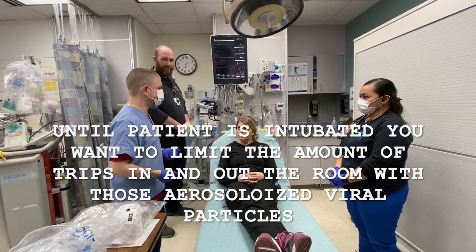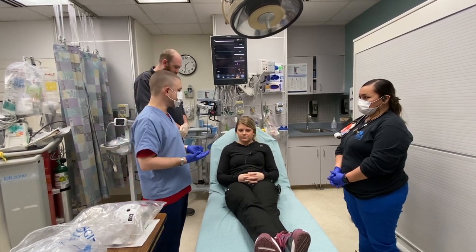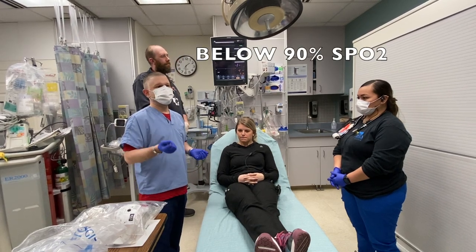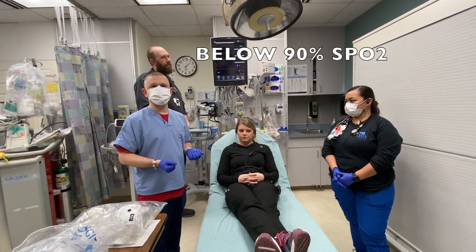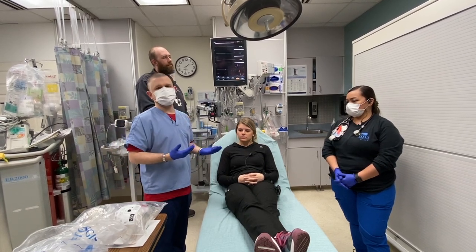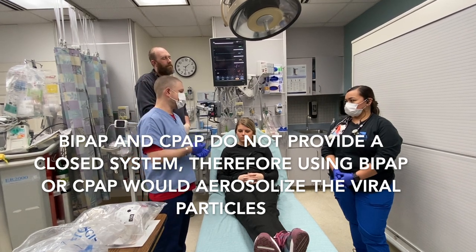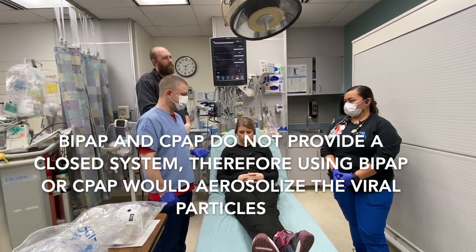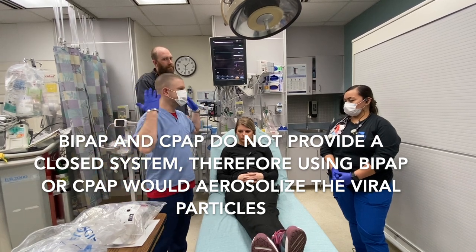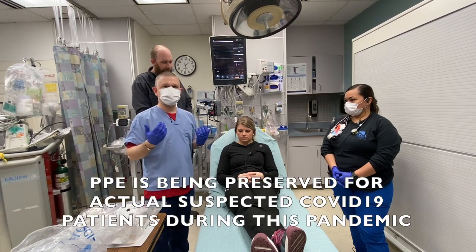Now, we have our patient here. She's suspected of having COVID-19 infection. She is desaturating on nasal cannula oxygen or non-rebreathing oxygen, so she needs intubation, because we're not going to use BiPAP or CPAP. That's the only option left. She needs to be intubated. So we are going to pre-oxygenate her. What you see here is our full PPE.